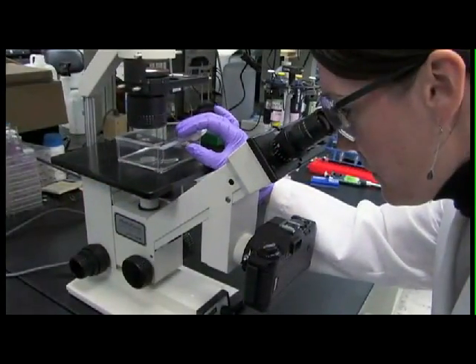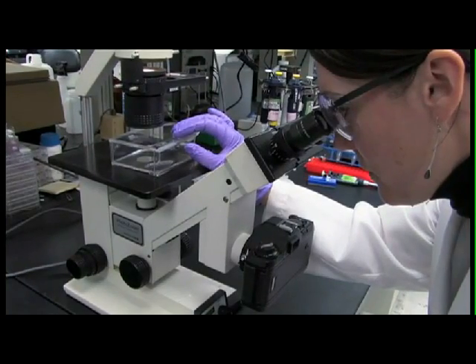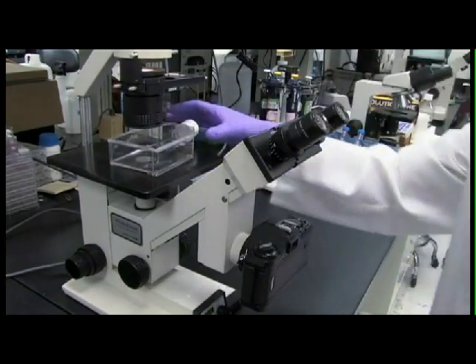Use a microscope to confirm the cells have released from the flask. They will start to appear round as they release from the substrate and will move or slide when the flask is tilted.